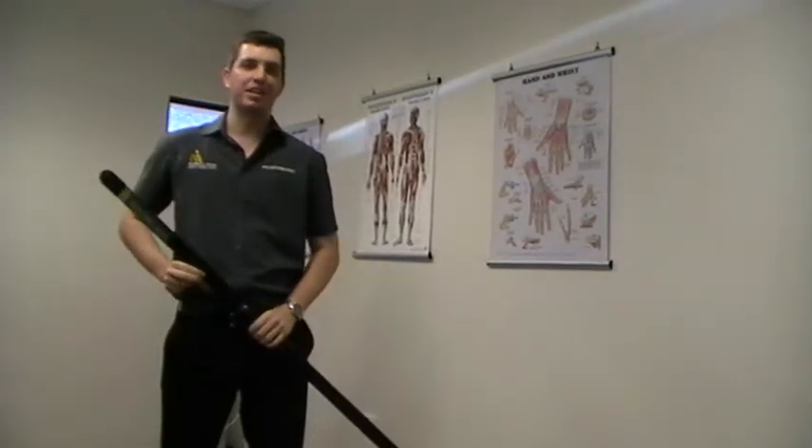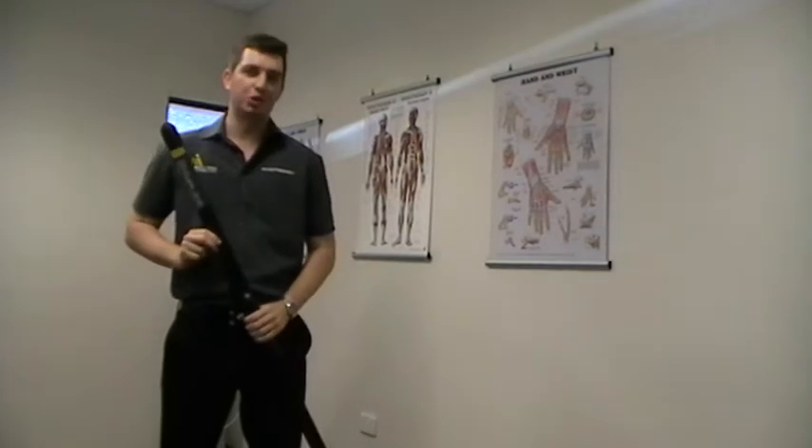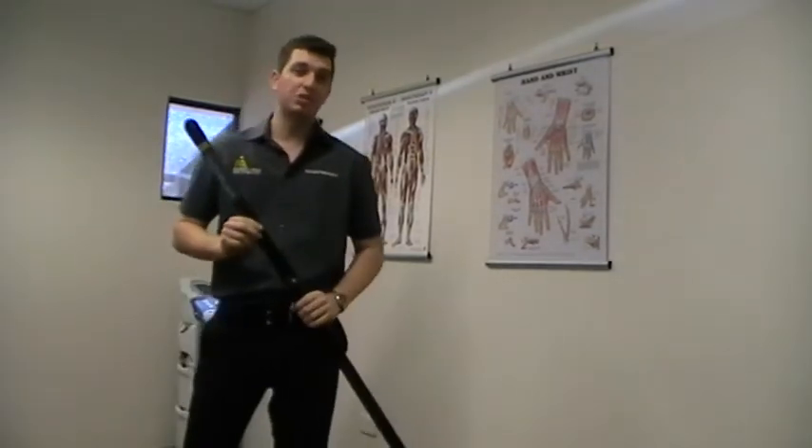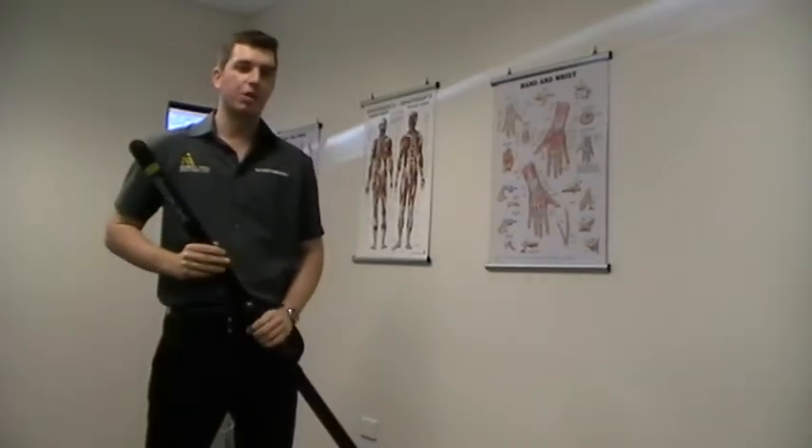Hi guys, Ben from A&I Physio here. Today I'm here to talk about the Body Blade Classic and how it can help you in shoulder rehabilitation. The Body Blade is a tool to increase strength and stability in the shoulder, and we use it here at A&I all the time.